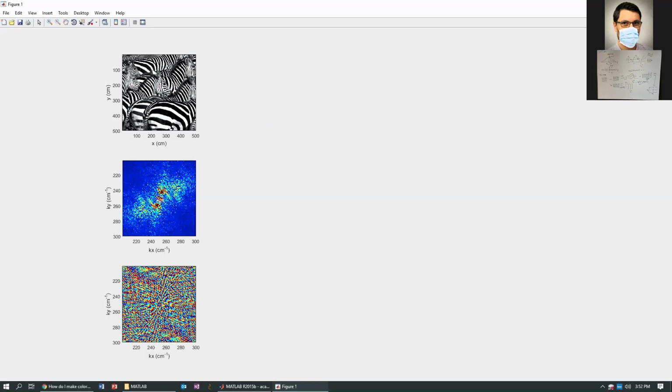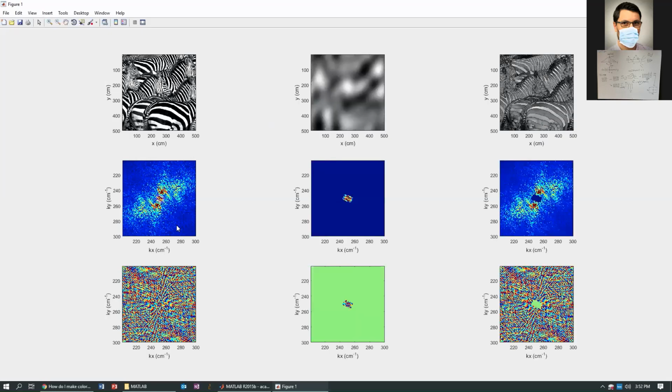this very center of the spectrum here, the signal that's right at the center of the spectrum. And so you can see in the second column here that these frequencies that are in the center of the spectrum essentially encode coarse details of the image, right? So they can tell the image is very blurry. There's very little detail in that image. And so all that information that's encoded in the center of the spectra are the low frequency details, the coarse details.